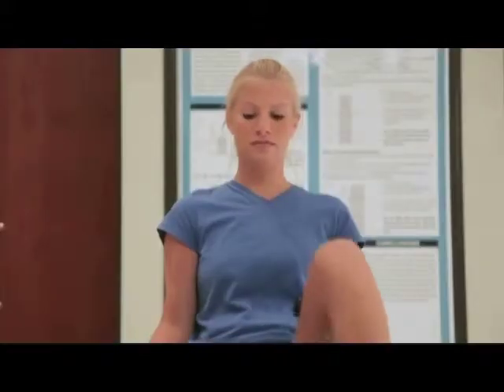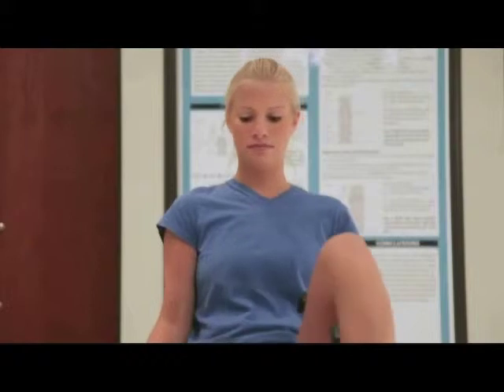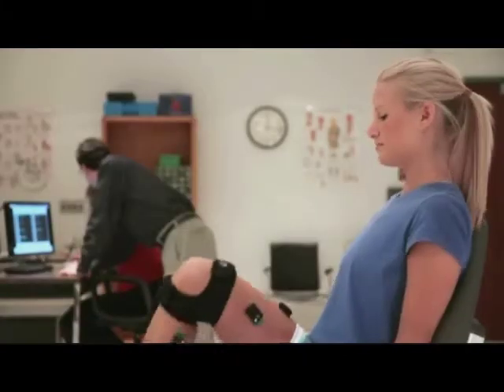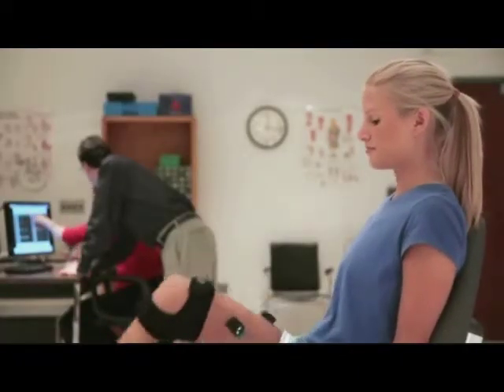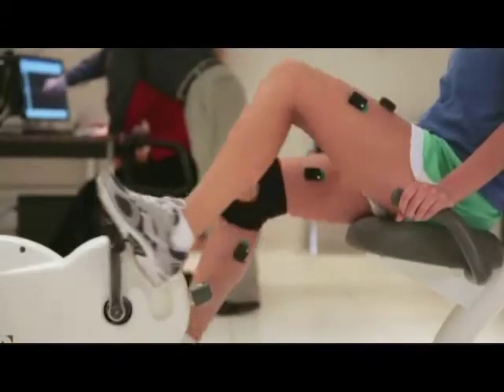They move to the stationary bike. The Trinio EMG system makes it extremely easy to change locations without any configuration adjustments. As long as the new position is within range of the wireless signal, changing locations is trivial. Thanks to the durable eight-hour batteries, many sessions can be recorded before there is a need to recharge.